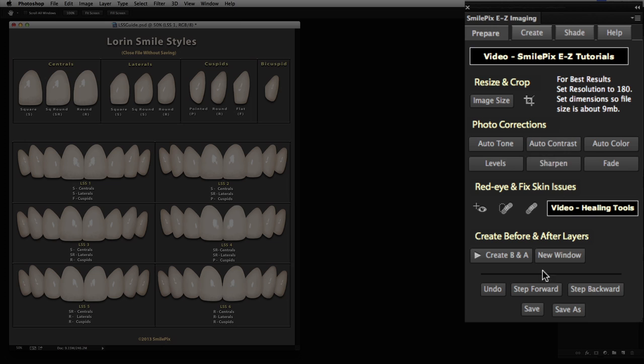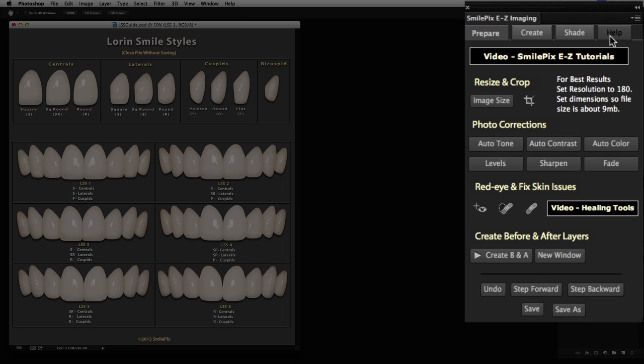...simulation, especially for those who are just learning Photoshop. There are four tabs on the panel.